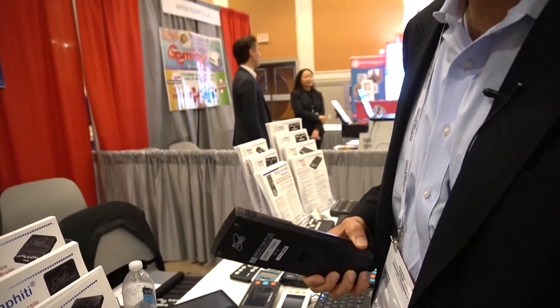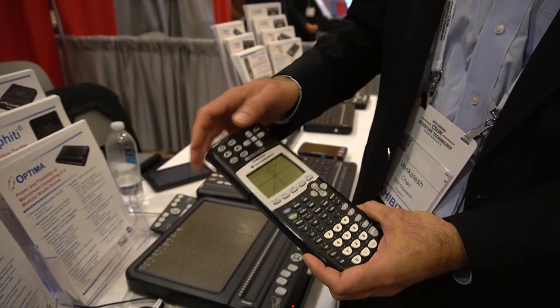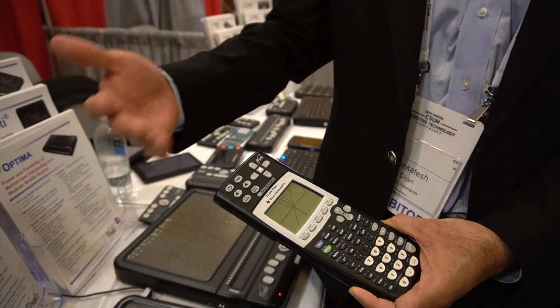It can also interface to computers or calculators — this is our talking graphing calculator, and we can connect it over USB and have the display mirror that. So if you're studying STEM subjects, you can get a live view in tactile form of the graphical data.